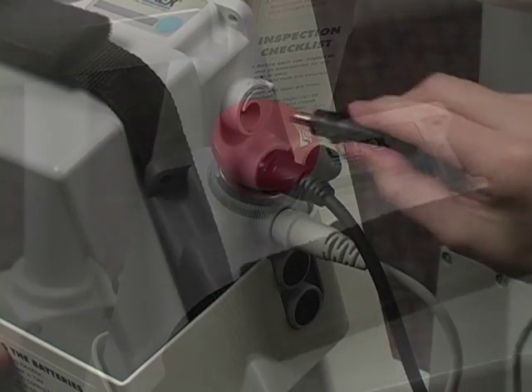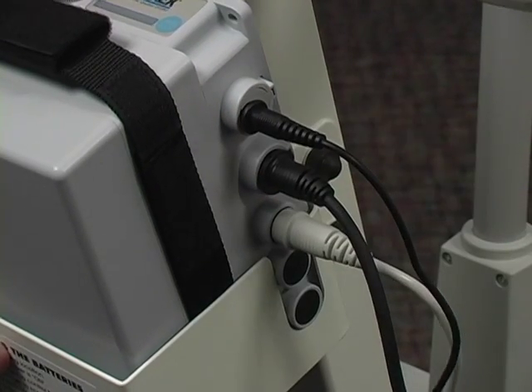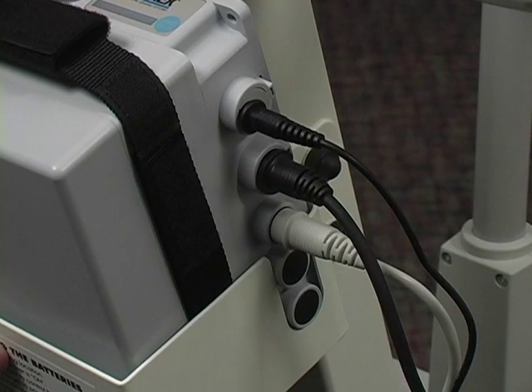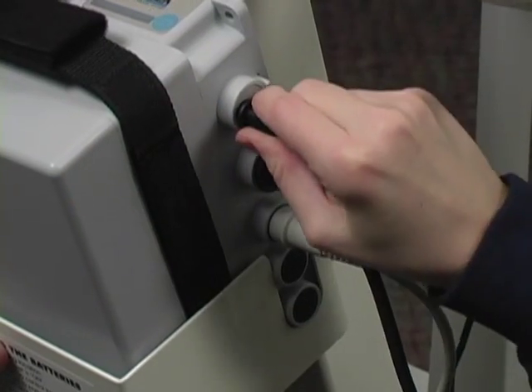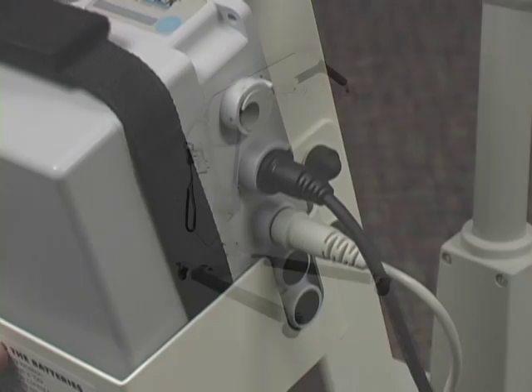Insert the charging plug into the charging port on the control box. All lights on the battery indicator should be on while charging. The red charge light will go out when the battery is fully charged. Do not charge the battery for more than 12 hours, as this may shorten the life of the battery. Batteries generally need to be replaced every 12 to 18 months on average. Unplug the charger before operating the lift.